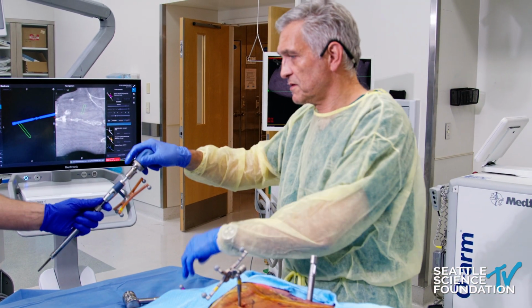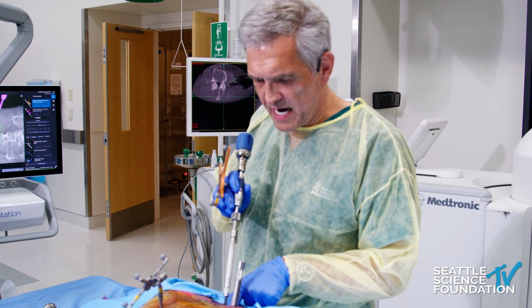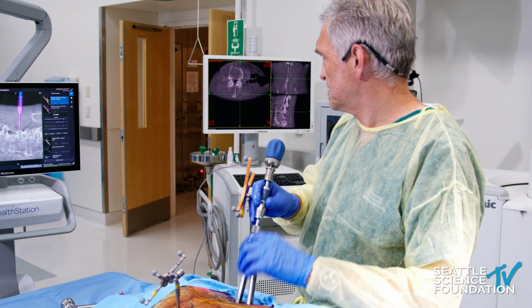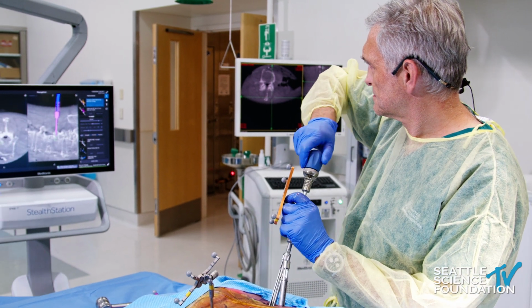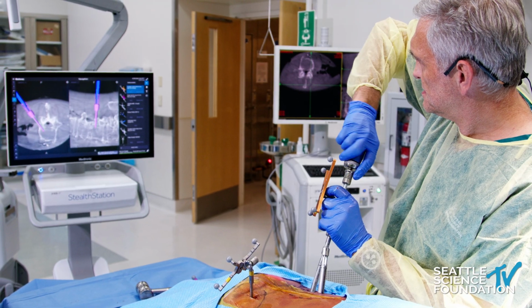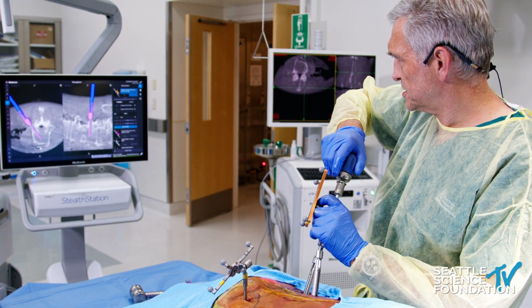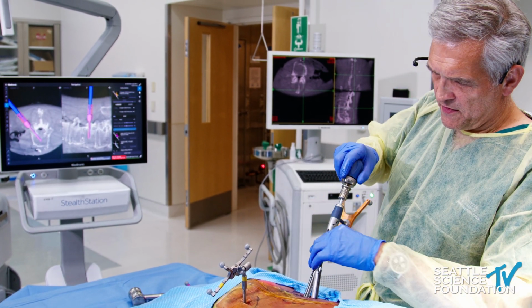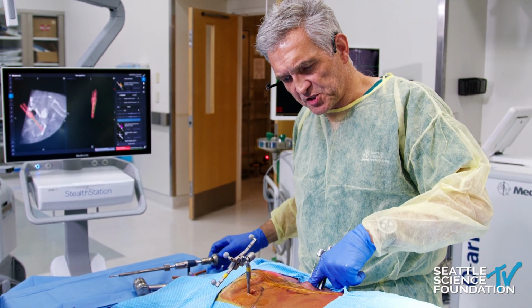Yeah, I really like that drill for percutaneous decortication of the contralateral facet joint. Works really well. Yeah, exactly, you can do that also. Yeah, get into the facet joint. Yeah, so that feels all good. And then the hands-off test, let go. So now the screws are in on one side. Obviously, the assistant would put in the screws on the other side.